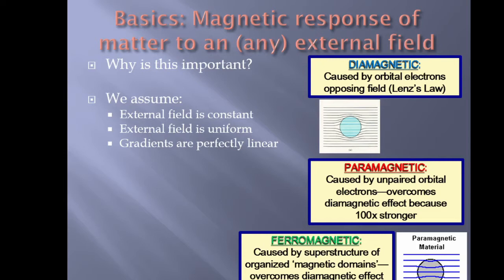And as a result, your RF pulse isn't going to activate evenly. You're going to get dispersion of your spins once it's in the XY plane. It's going to cause you to lose signal. All sorts of stuff happens. So obviously, diamagnetic effects are the least important. Paramagnetic effects are stronger. And then ferromagnetic effects are destructive, like that image I showed you with the dental work. There's ferromagnetic material on there.